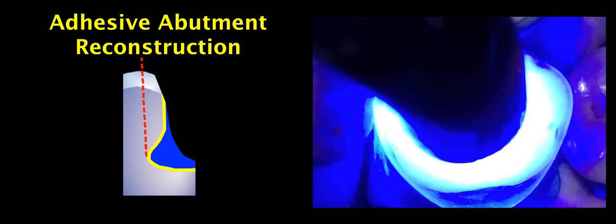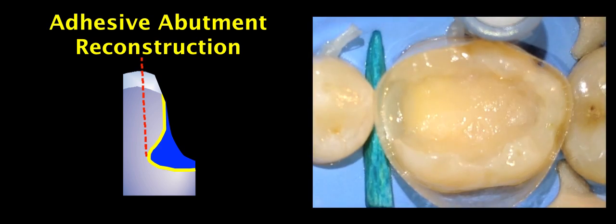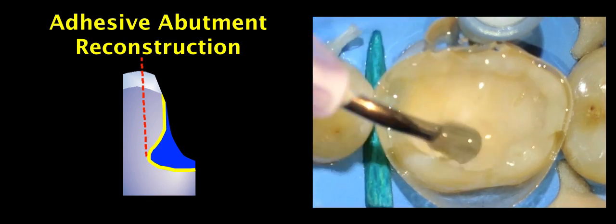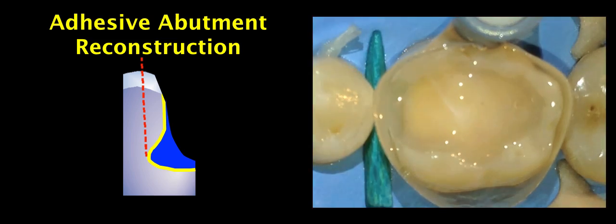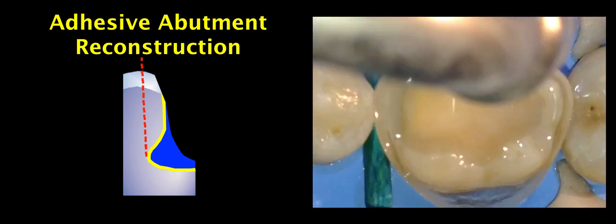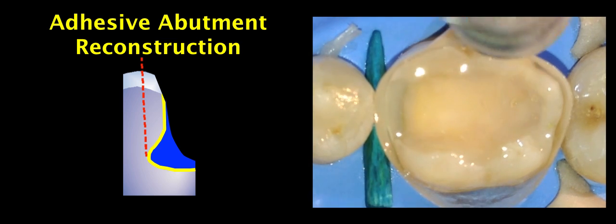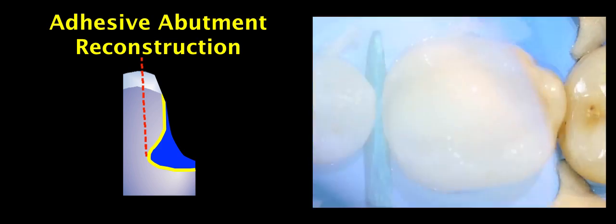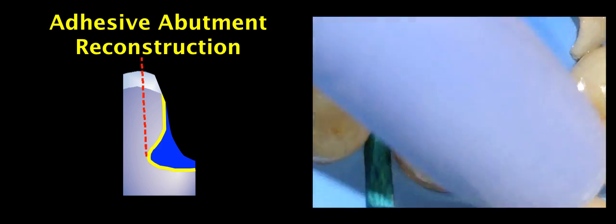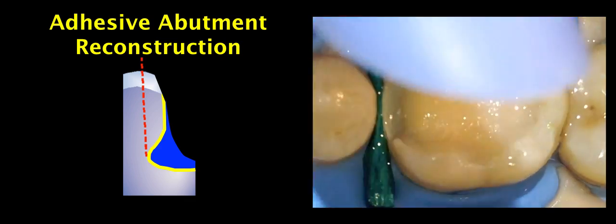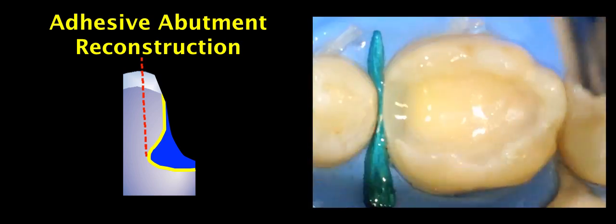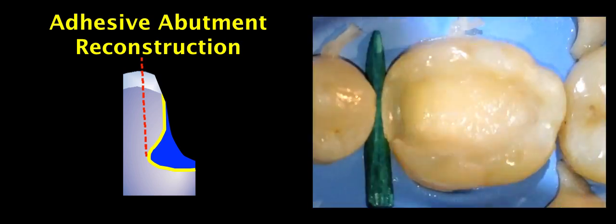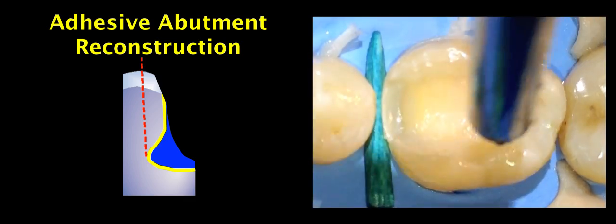We've now finished with adhesive reconstruction of the abutment but it's mandatory that we don't have any uncured polymer or uncured resin on top, so that's why we use a glycerin gel in order to do a final polymerization and avoid having the oxygen inhibition layer on top of our preparation. Now we've finished with adhesive reconstruction of our abutment. The matrix can be removed. Of course we could make an impression at this point and it has been proposed, but I think it's much better if we finish the margins and make sure that we have enamel at the borders.